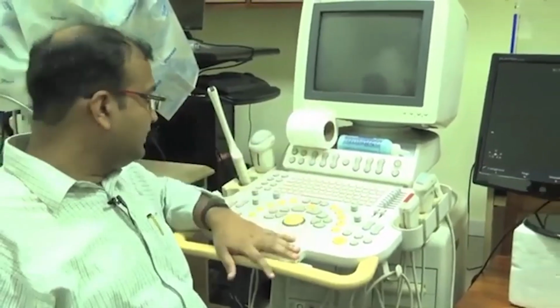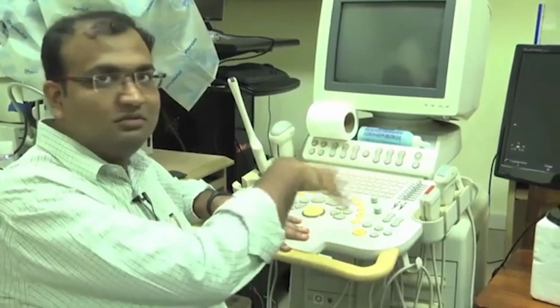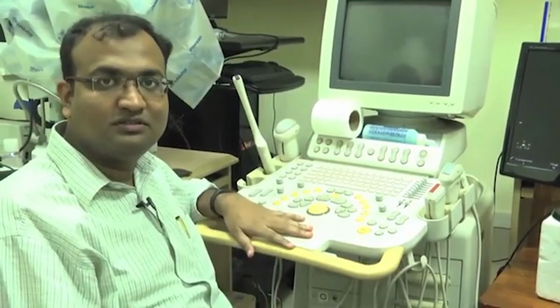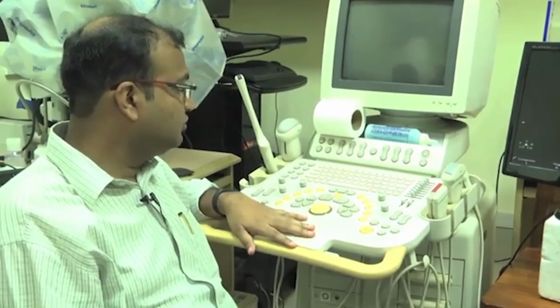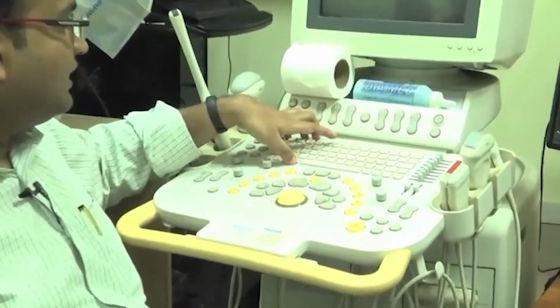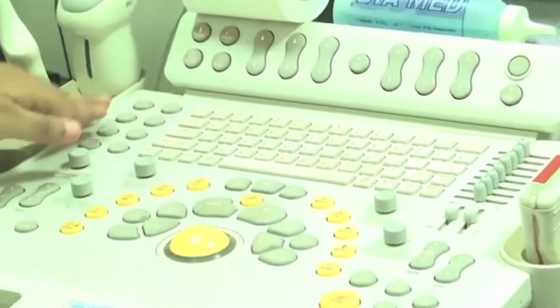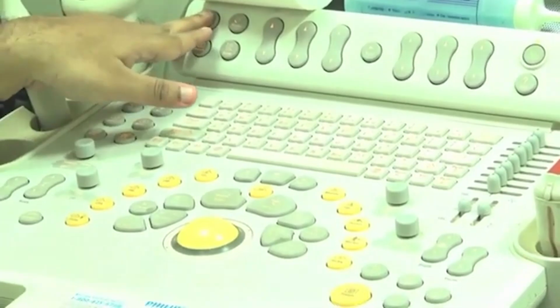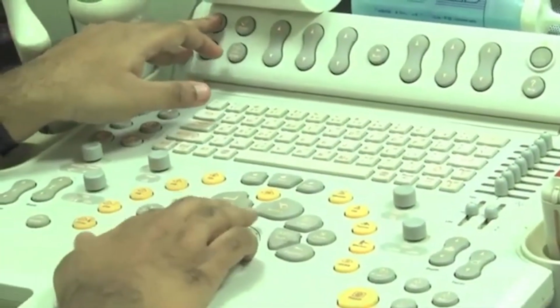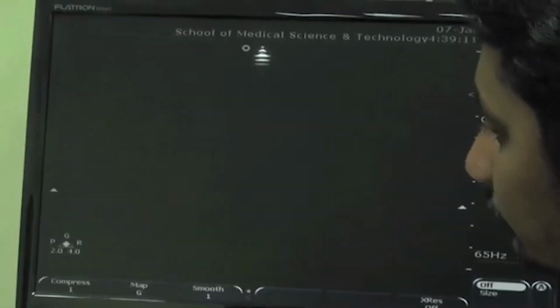Okay, so today I am going to show you a demonstration of one of those practical ultrasound machines, and you have already seen something similar to this image in the presentation we did on ultrasound imaging. To give you a closer look, you have a keypad over here, which is quite a generic keypad, and its purpose is to enter all textual information related to the patient. I can click over here and start up a patient session, create a new patient and enter all the details, then click OK, and the patient information gets saved.